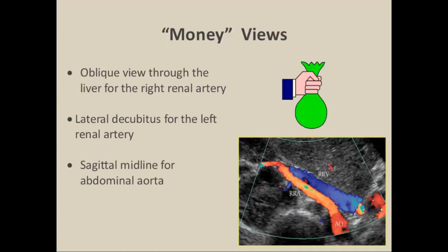I call these the 'money views' — the views that allow you to get maximum information in a short period of time. The money view for the right renal artery is typically the patient slightly right-side-up, scanning through the liver. Here we can see the right renal artery in its entirety — right from the origin at the aorta into the hilum of the kidney. From this one view, we can sweep the sample volume and angle-correct the direction of flow through the artery, capturing peak systolic velocities for evaluation.